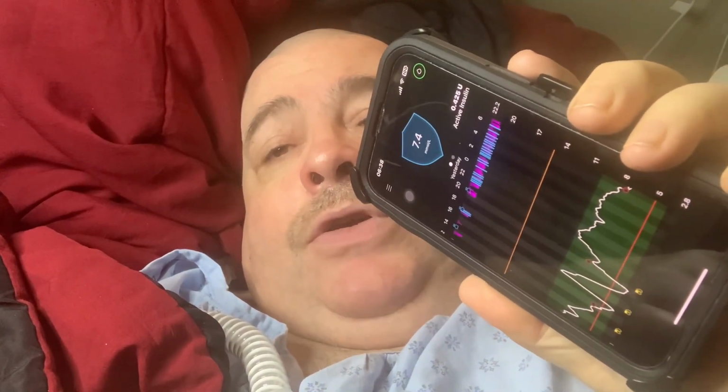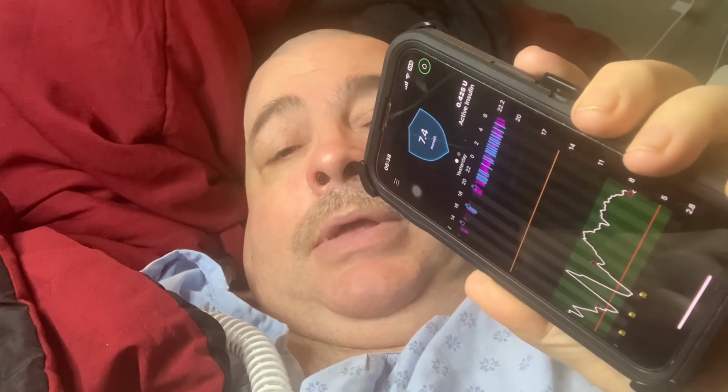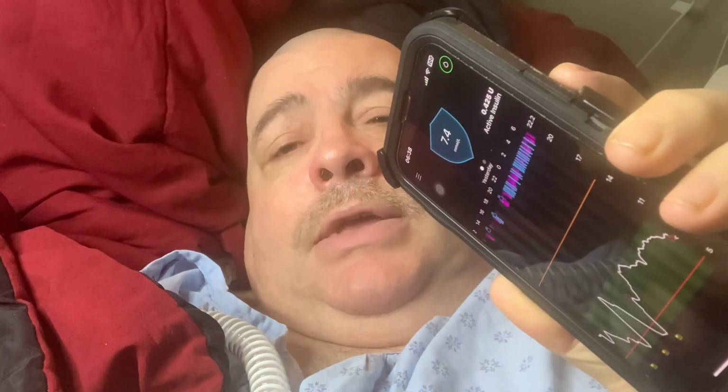But the best way to treat a low is to monitor. Have it on your phone all the time. Let your body know what your blood sugar's at. Don't get confused by thinking, no, I'm not low. At 7.4, I function fine. Anywhere above 6, probably mid 5s, I function fine. But the doctor has set my goal at 6, nothing below that. And then we start my treatment.